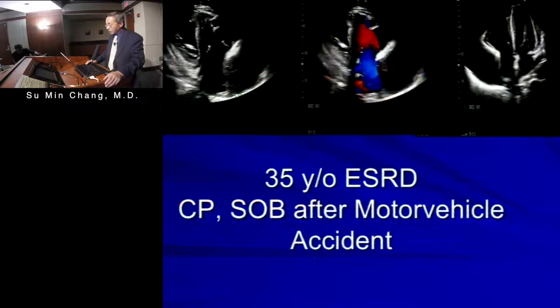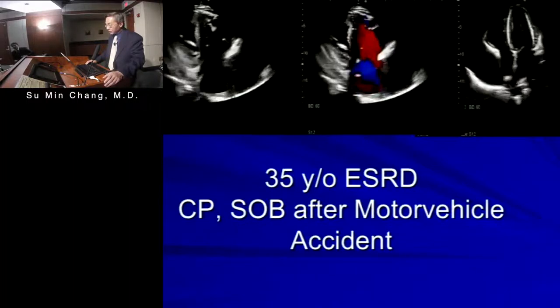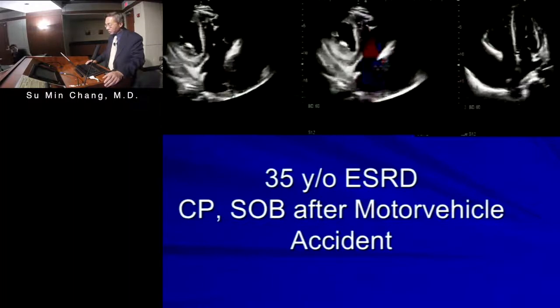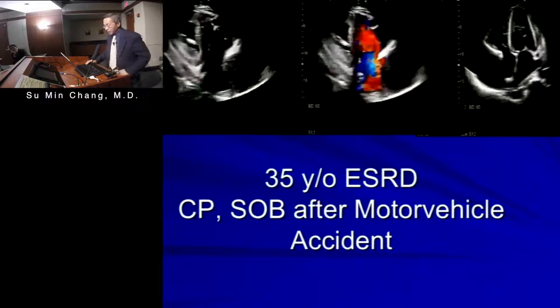Just a quick case here: a patient on dialysis shows up after a car accident short of breath. As you can see there, a wide open TR, and kind of a mass compressing the right atrium right there.